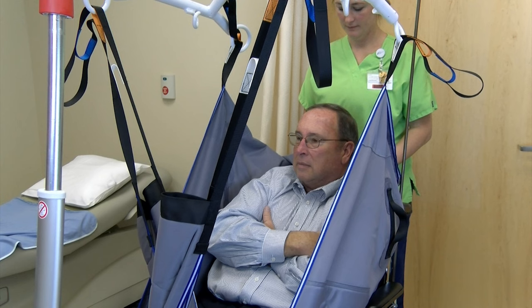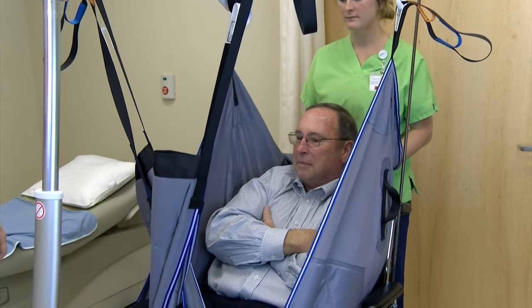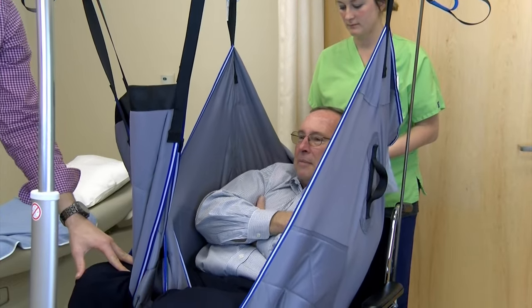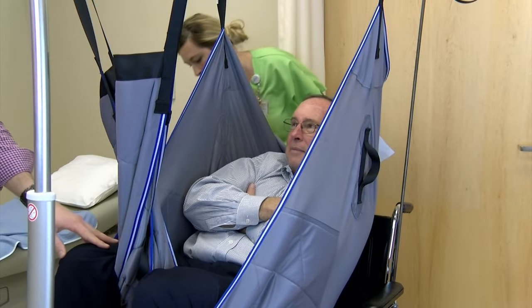Make sure that the patient's arms are crossed and inside the sling. Unlock the rear casters of the Hoyer. Slightly raise the patient with the lift just enough so that the patient's bottom is almost off of the chair. Double-check that all of the straps are secure.